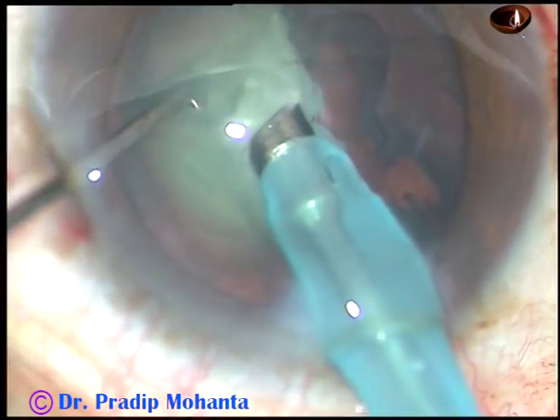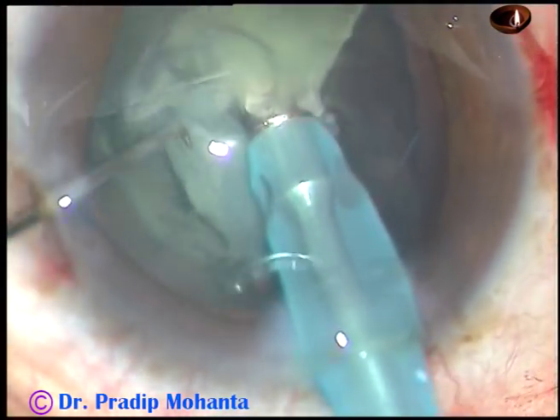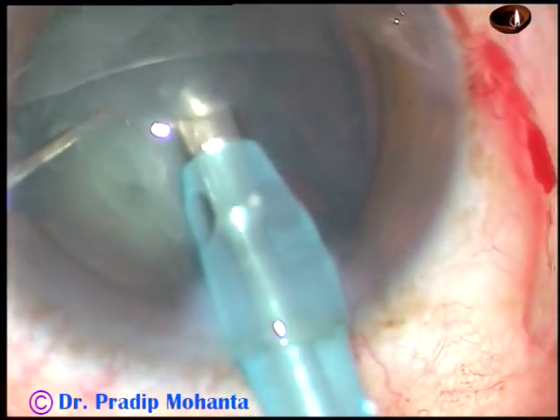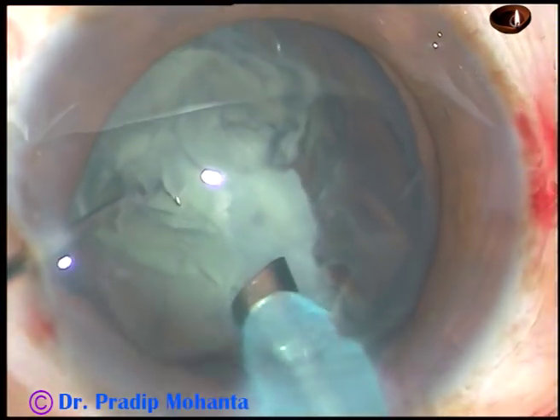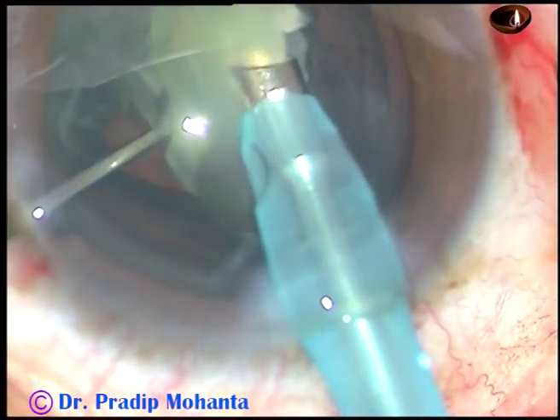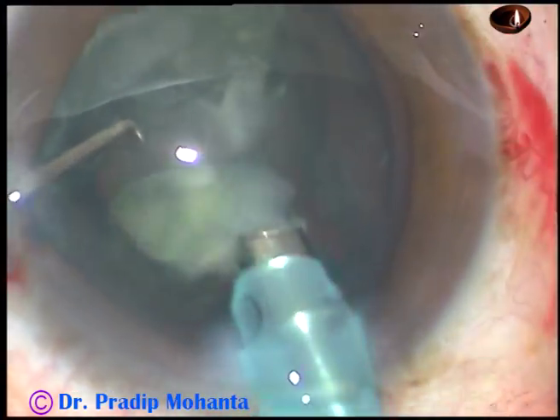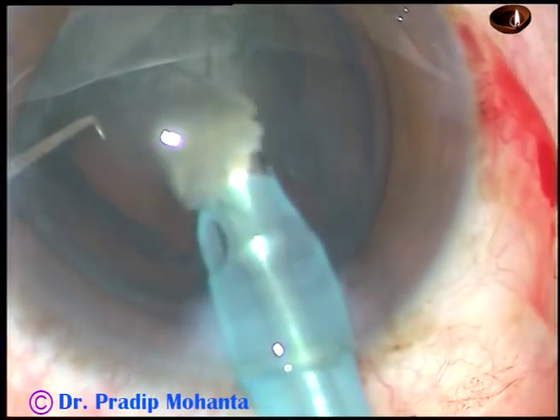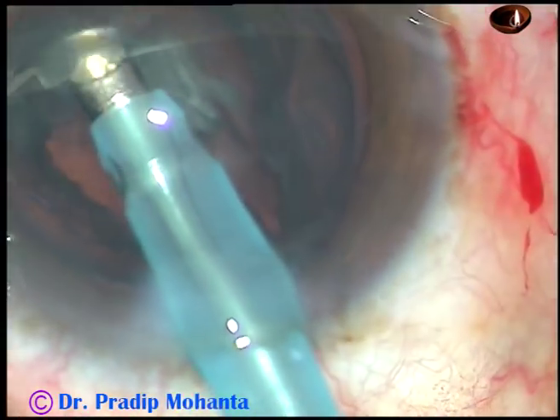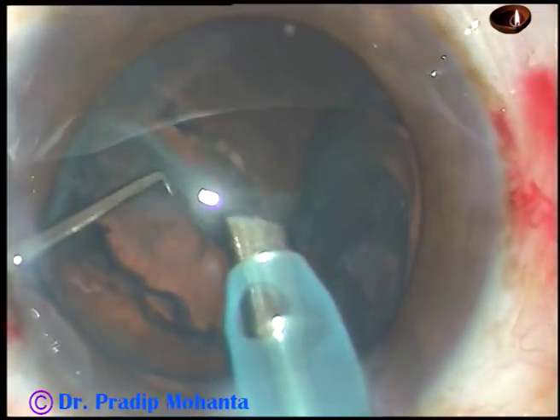Now I bury the tip on the left side, chop this and remove this piece of nucleus, hold this portion of the nucleus, bring it out from the epinuclear shell and emulsify it. So the nucleus has been nicely managed without hydrodissection.